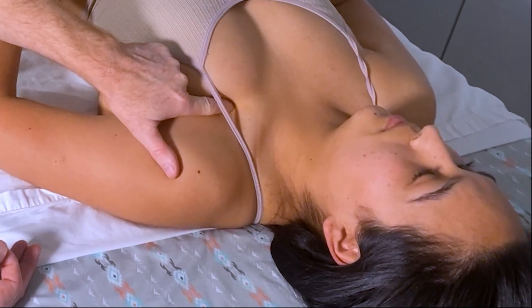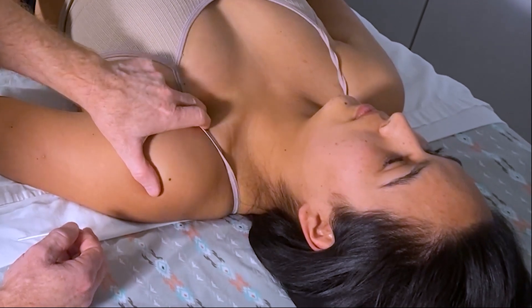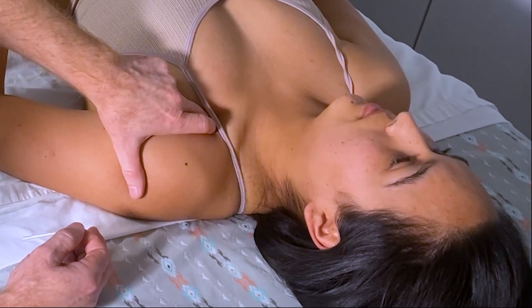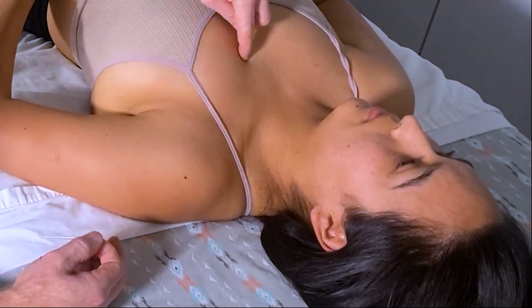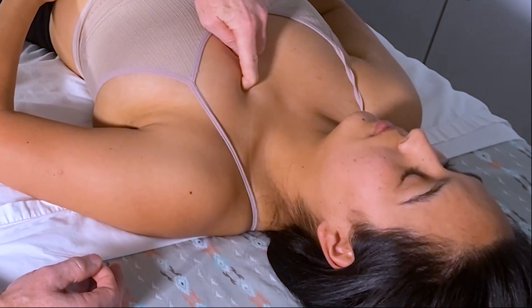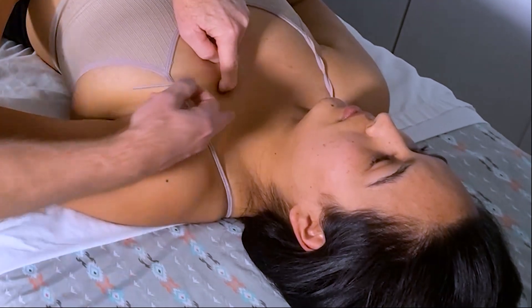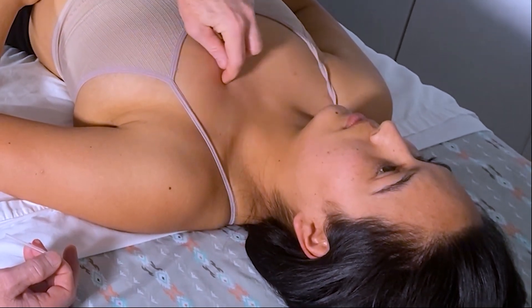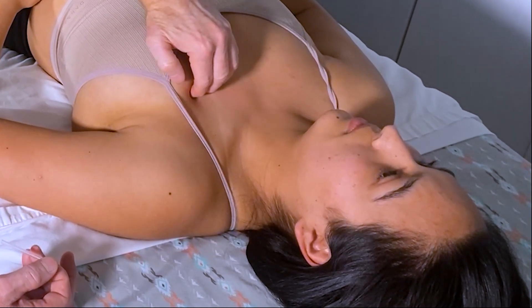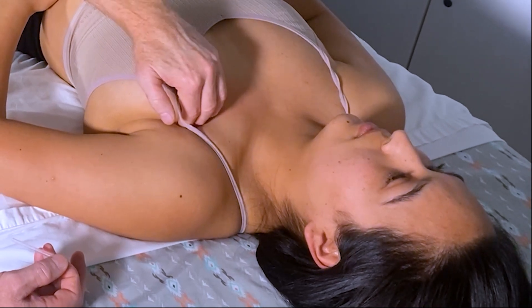Let's go over this technique again on a female model. When palpating, I want to feel for the clavicular fibers. I can press into fibers going from an inferior to superior direction, or from a superior to inferior direction, feeling for resistance. It doesn't feel particularly taut, so I'm not going to needle those fibers. I can palpate close to the sternum, looking for taut bands — there's one right there through that sternal fiber. Sometimes you'll even see a local twitch response as you palpate through. Interestingly, I can see a little bit of that local twitch response travel up through the SCM muscle, which those pec fibers do link with.